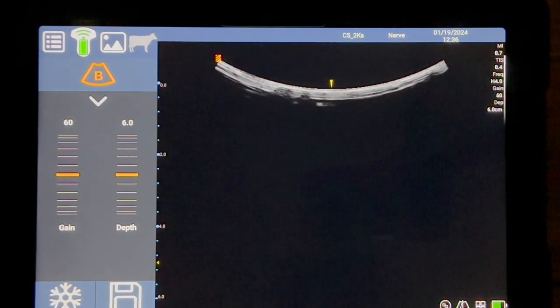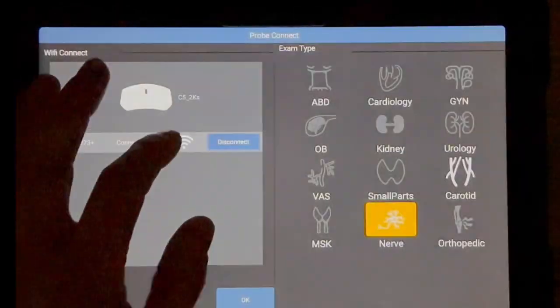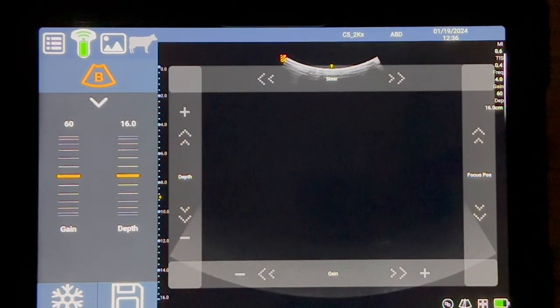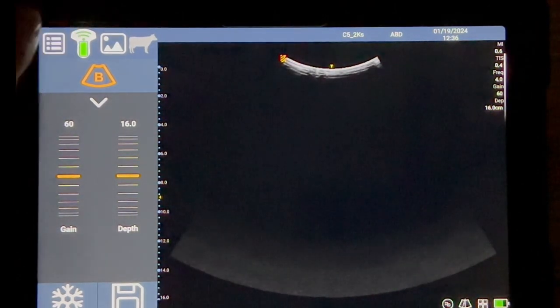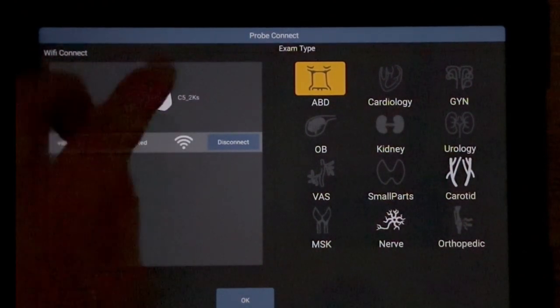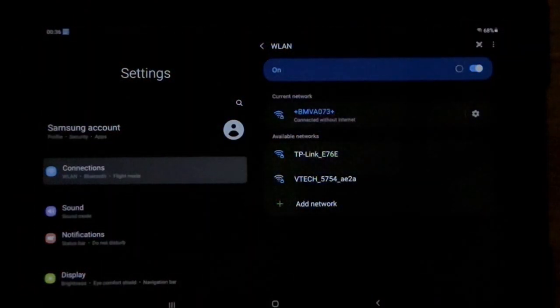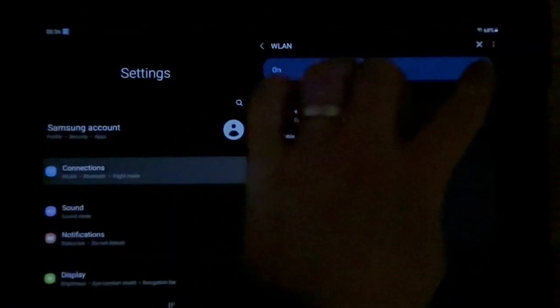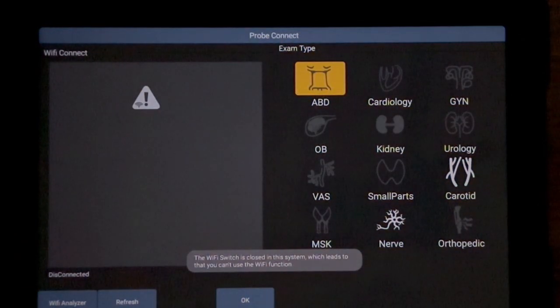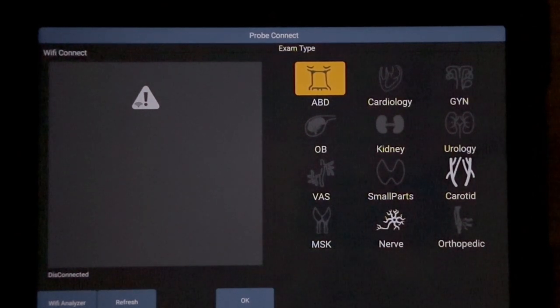Coming back to the live image — if you then want to go across and use your goggles, we advise you tap on the connection and press disconnect here. It'll pop up a menu and we advise you turn your Wi-Fi off on the tablet. This means that when you turn your goggles on, they will then automatically connect back to the goggles. And vice versa — that is how you switch between using the tablet and the goggles.